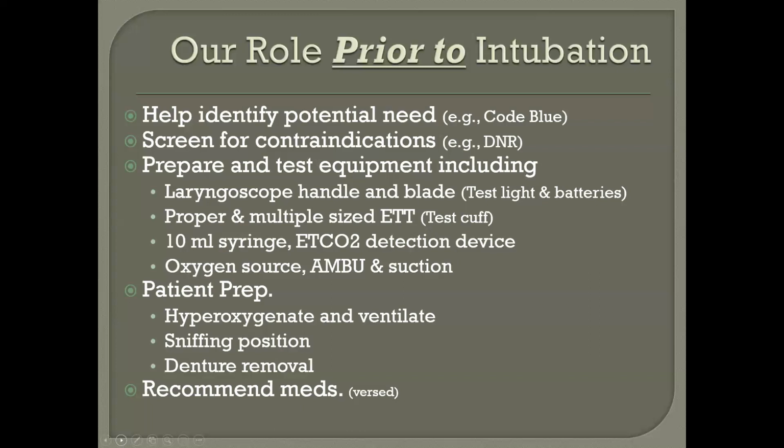It not only is useful in determining the tube is properly placed, but in a resuscitative effort, it also gives you a decent idea as to the quality of the resuscitative effort, how good the compressions are, and if the patient returns to ROSC. If they return to spontaneous cardiac activity, you'll pretty much see an abrupt increase in CO2 owing to the fact that now they're circulating blood around, and it's not through artificial means. The patient's heart has kicked in.